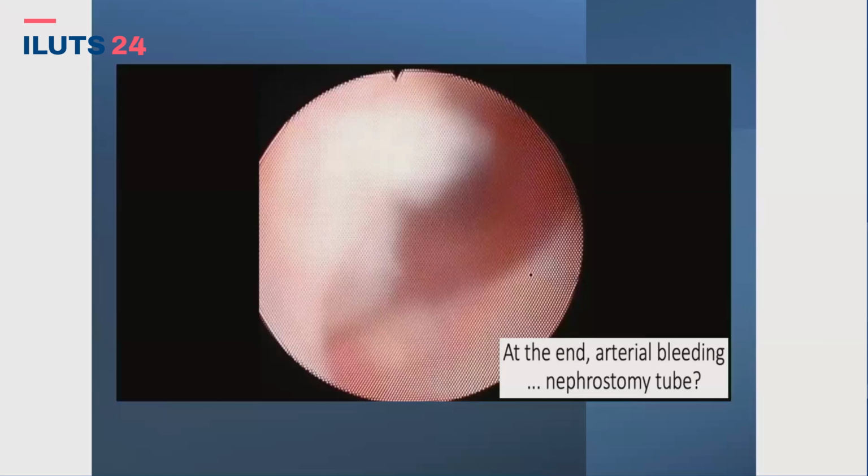Danny. So the vessel is asking you for coagulation, so I'll try to use it, but sometimes it does not work. So it's not that easy. It looks easy, but I don't know if it's the structure of the parenchyma. It's not akin to that of the prostate, in which we know how to coagulate the vessels. Here it works a little bit less well, but I give it a try for sure.